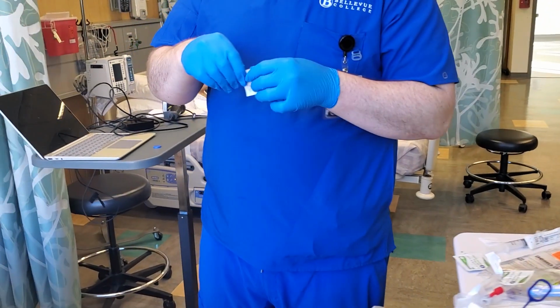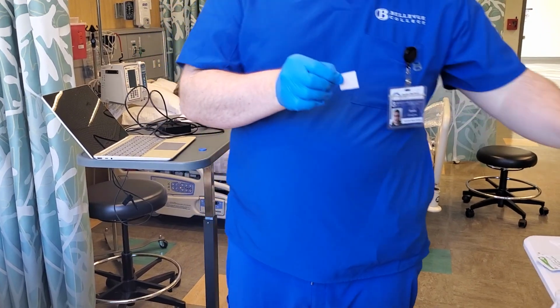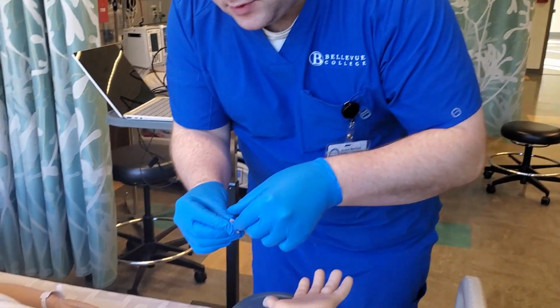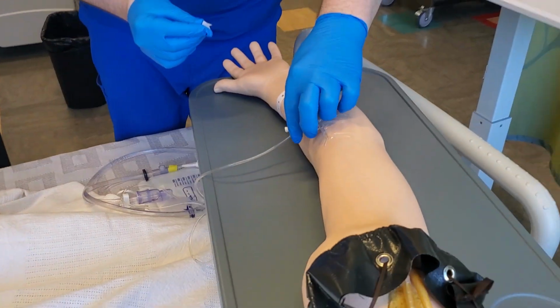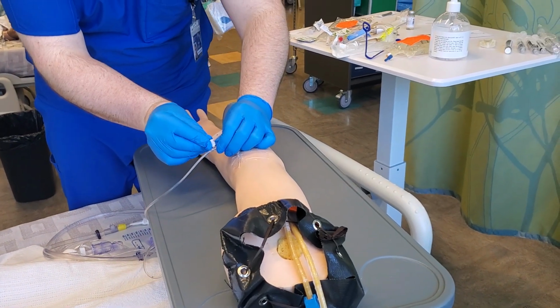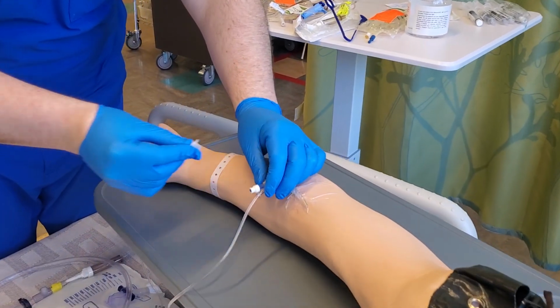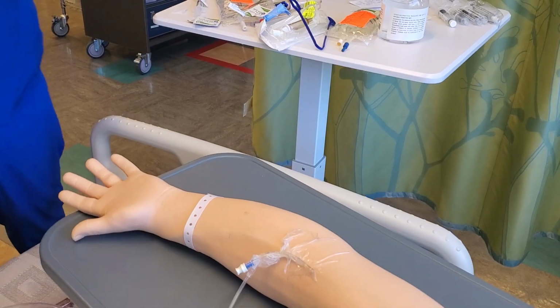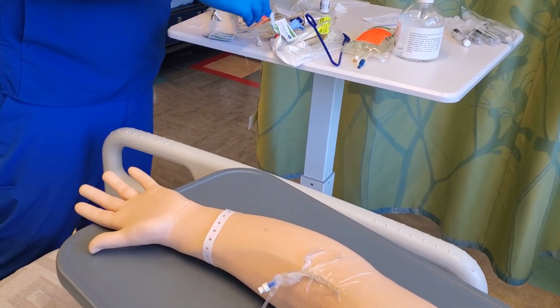We're going to scrub the port here. We're also checking for any infiltration and inflammation at the site. We'll do this scrub for about 15 seconds and do 5 seconds of air dry. Then we're going to go ahead and do a flush here.